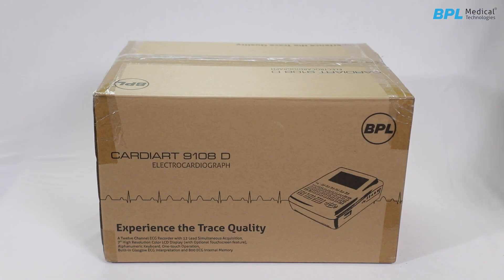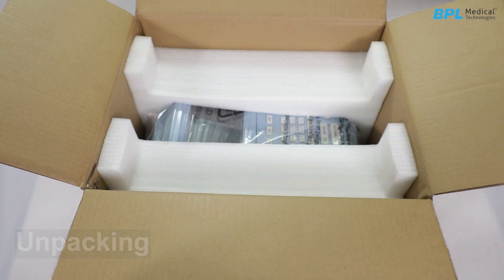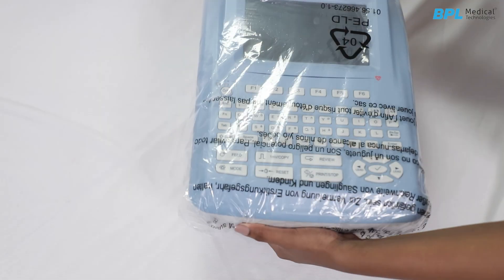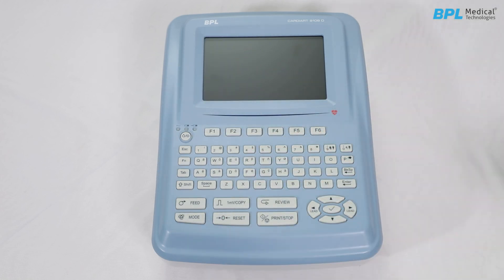Introducing BPL Cardiart 9108D. For unpacking, carefully remove the ECG unit and the accessory case from the carton box. Check for any damage to the unit. If damage is evident, please notify BPL or the service team immediately.